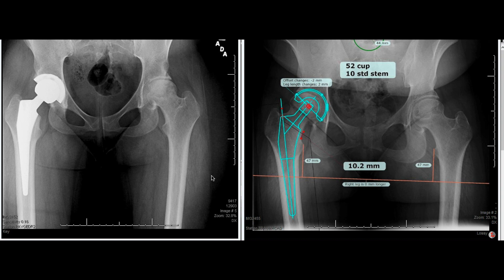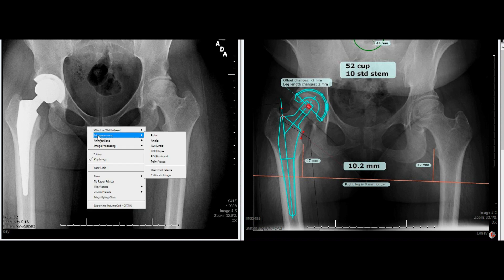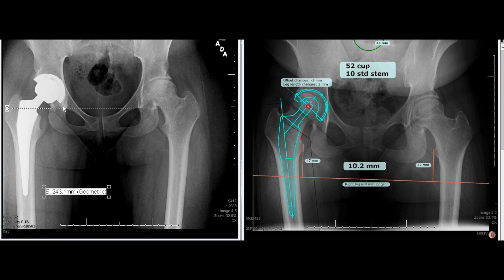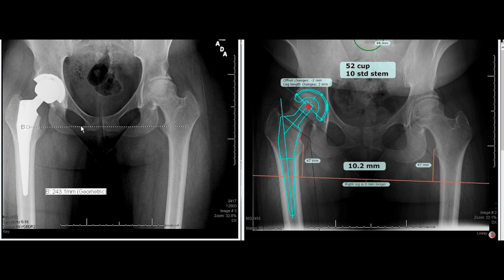We will now move on to evaluate the implant positions. We will start by drawing a leg length line across the teardrops, which are well visualized on this radiograph. We now take this line once it's drawn and move it down to the level of the lesser trochanters. You can do this off the bottom of the ischial tuberosities or off the top of them — it should be fairly close to flush with the tuberosities as a comparison. I will then look and see where this strikes on the lesser trochanters. In this case, it has restored the leg lengths, or maybe just a touch long on the right, with plans to return to do the left total hip replacement. We can then also look at our offsets and see the standard stem has added just a little bit of offset.